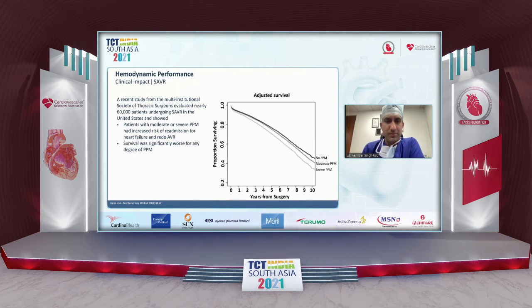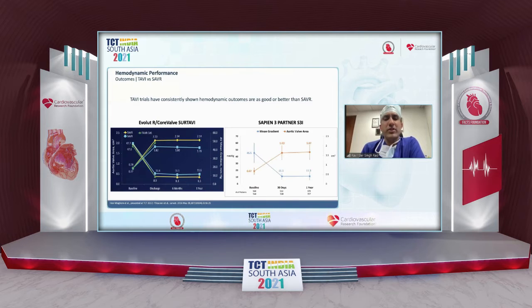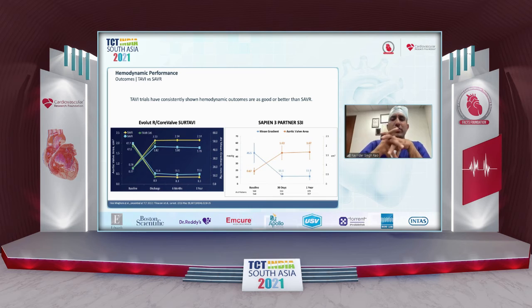hemodynamics of the patient. We all know from the surgical literature that patient-prosthesis mismatch is a poor predictor of outcome, even at short-term and long-term follow-up. And it also does not allow the regression of LV diastolic dysfunction if the patient continues to have patient-prosthesis mismatch. I'm not going to go into this slide because it's been presented multiple times.